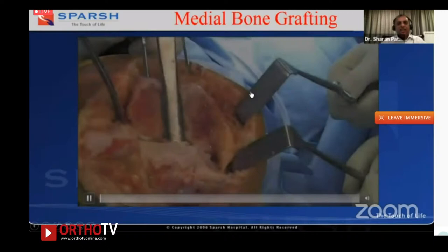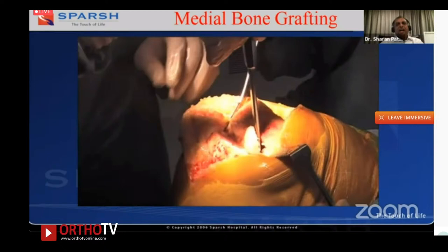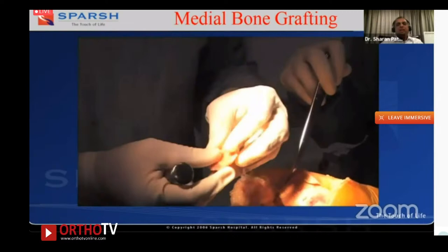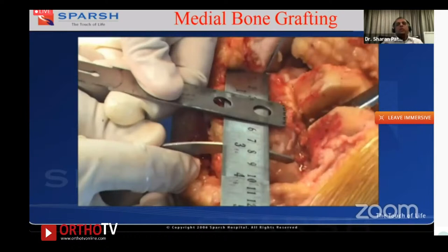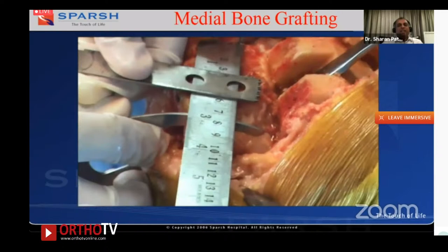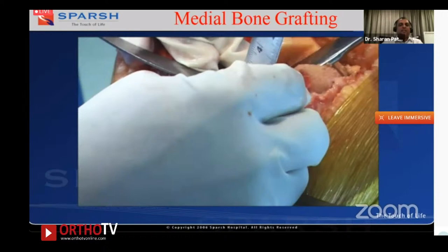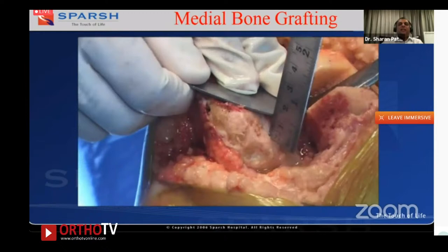Let me take you through a quick video showing how to bridge a bone defect. In this video, there is a huge medial defect. When you take away the posterior condyle with your cuts, it fits nicely into the defect. I use the bone itself to reconstruct the defect rather than wedges or metal. I have about 40 cases done this way with good long-term results.